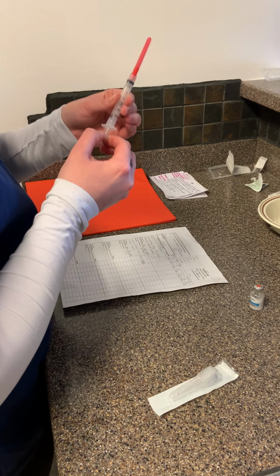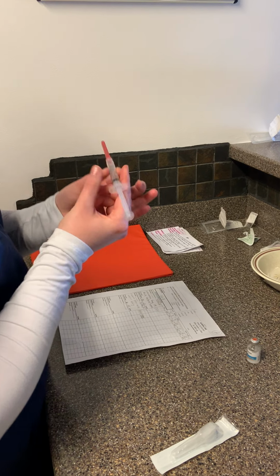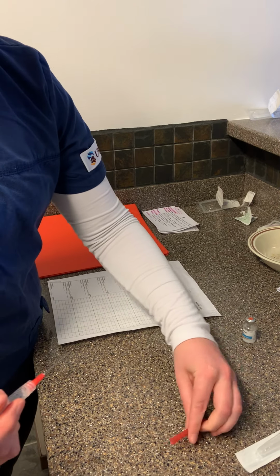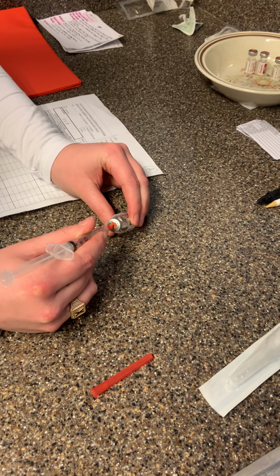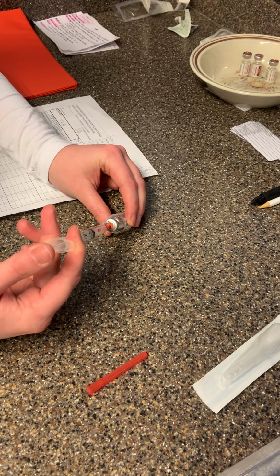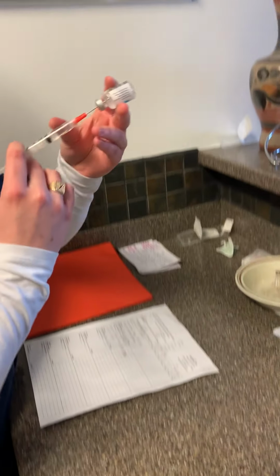While that is drying, I'm going to draw up 3 milliliters of air. So now the vial is dry, so I'm going to inject the 3 milliliters of air into the vial, and then I'm going to start drawing up my medication.